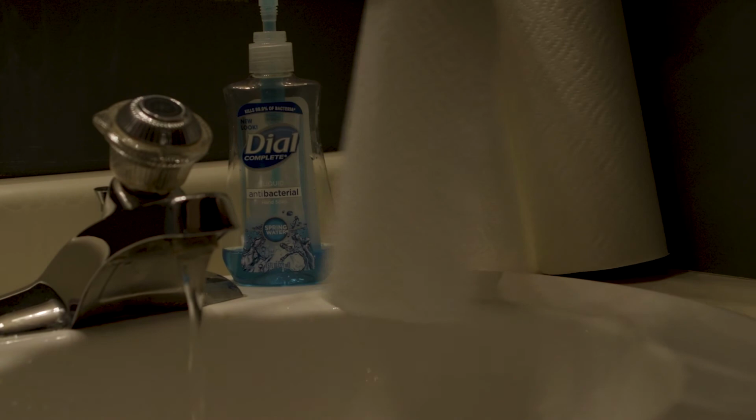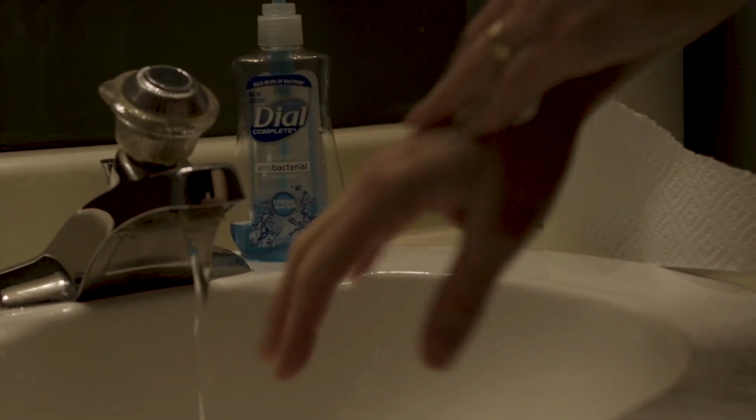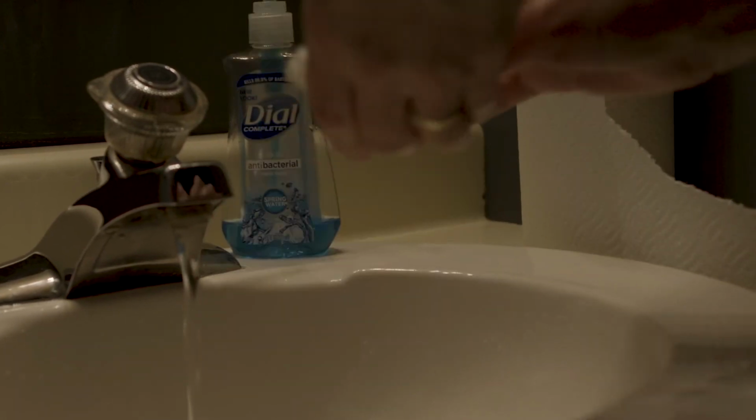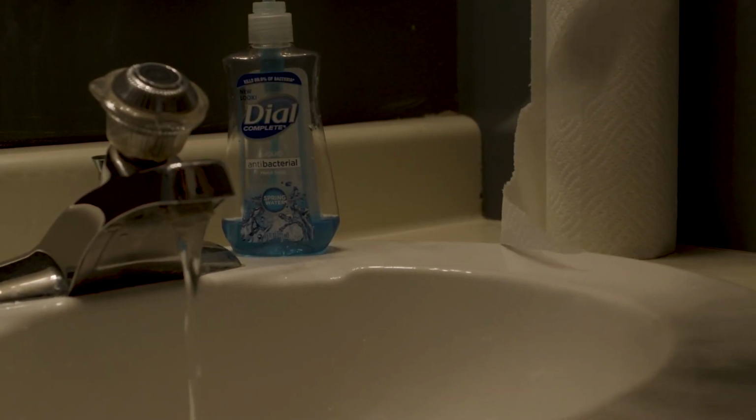Wash your hands thoroughly for at least 20 seconds and dry as well. Use a separate towel to turn the faucet off. Proper enteral bolus feeding at home is important to your safety. In the event of an emergency, always call 911.